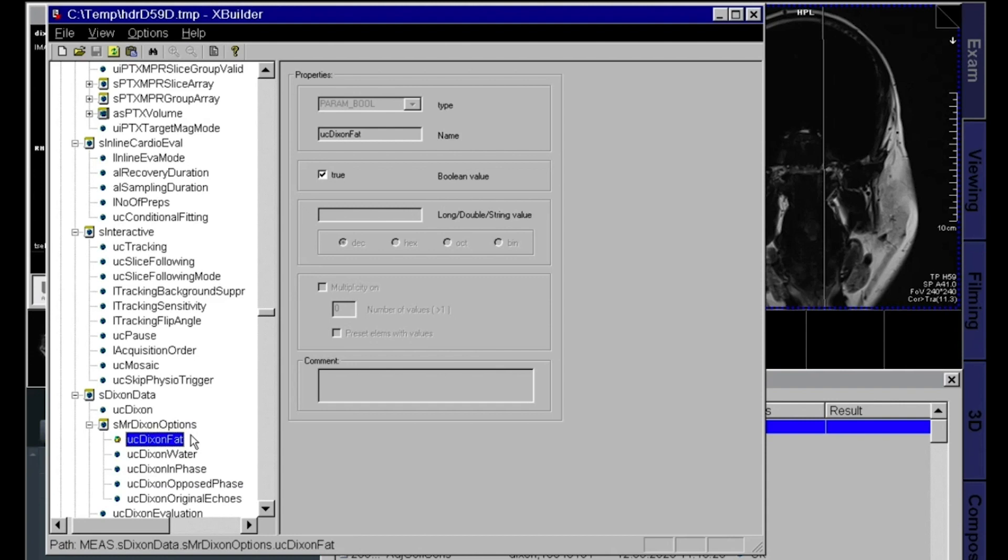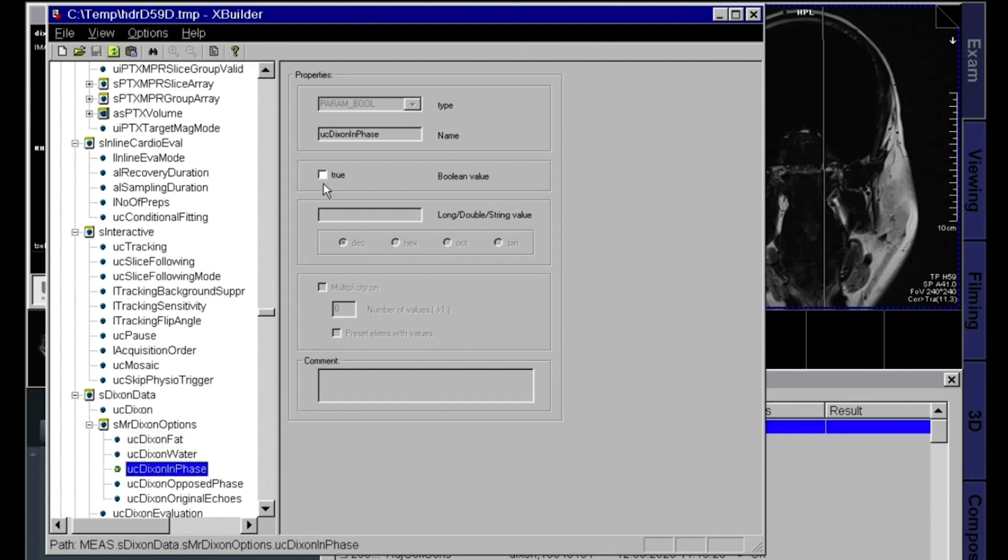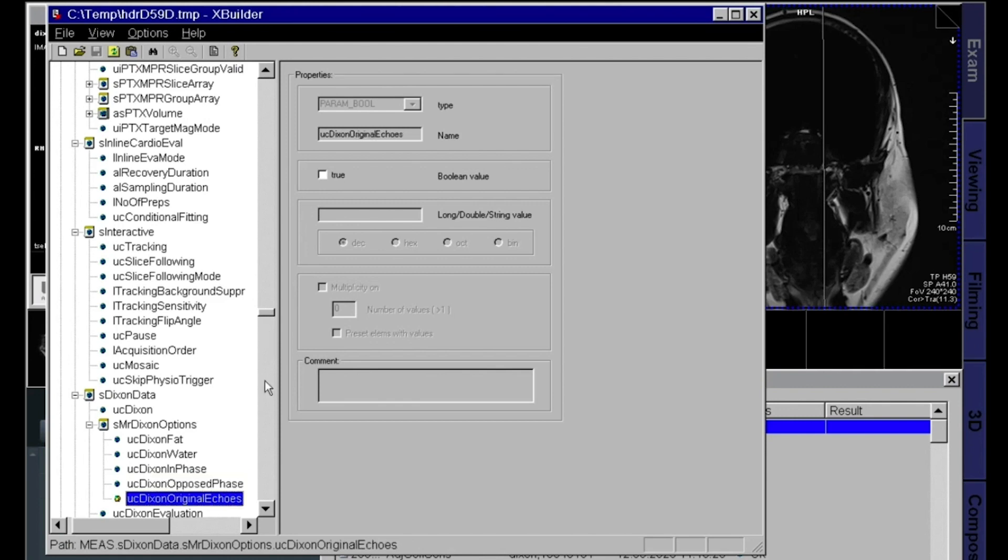Okay, fat only we have that on because that's true there, and water is also true because you had it on. Then you have the in phase, you had that off. Opposite phase was off. And original, that represents in phase and opposite phase. Having the original echoes on will provide you in phase and opposite phase, or you can just have the in phase or the opposite phase, up to you.